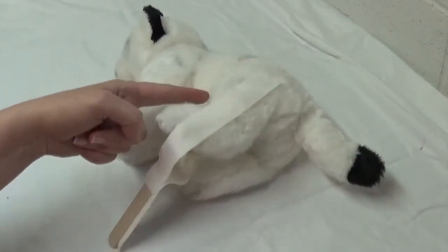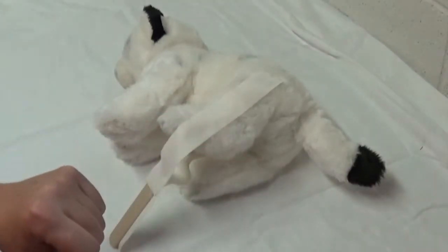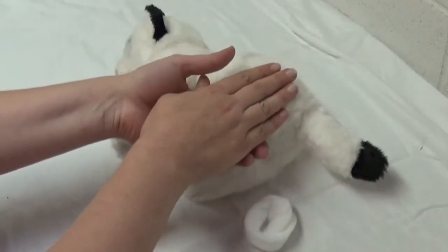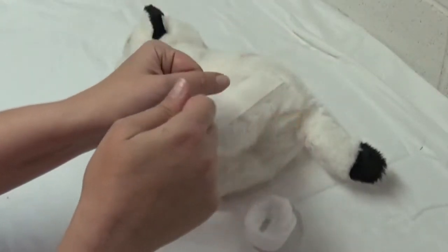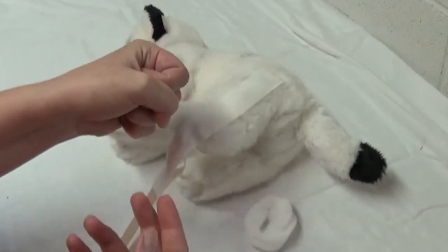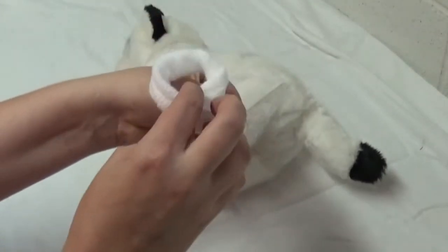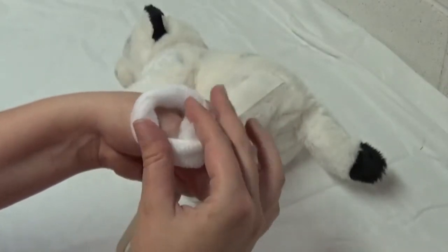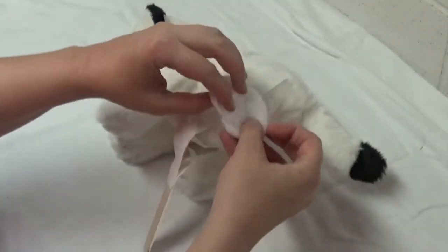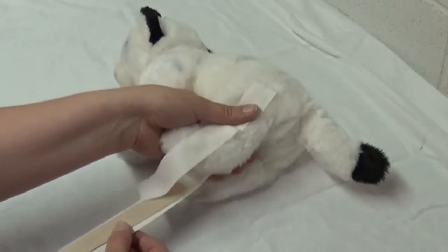The primary layer: if we have any wounds, go ahead and cover that wound — that's our primary layer. Now, if we have any bony processes — think about a greyhound with all those big bones sticking out — this is kind of a pressure bandage, so it's going to apply a lot of pressure to those bony protuberances, and you can end up getting a pressure sore or decubital ulcer. What you can do is take your little donut and put it around the bony process, so when you apply pressure, there's less pressure applied directly to that process — going around the natural bony bits coming out of the patient.